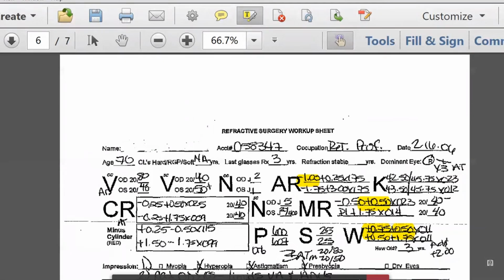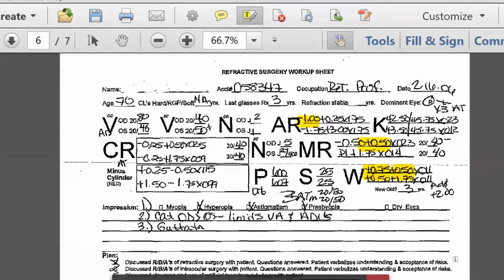The surgeon will probably have one keratometer that he would trust the most, the one the surgeon would most rely on, and the other keratometers are probably just there for him to make a cross-reference check. So the key is which instrument the surgeon is most comfortable with using, and which one he has been consistently using for his IOL calculations. That would be the one that is likely going to be best used for the surgeon.